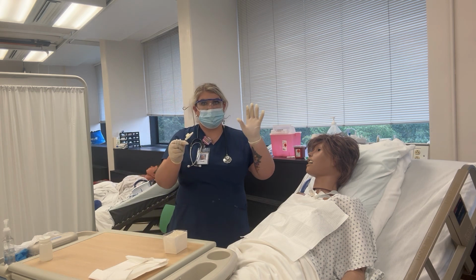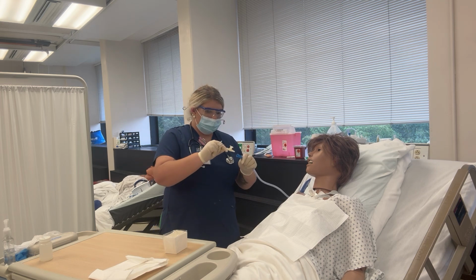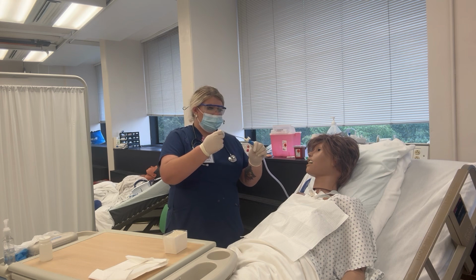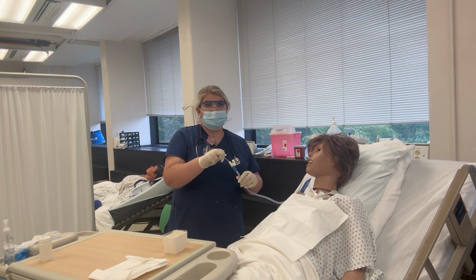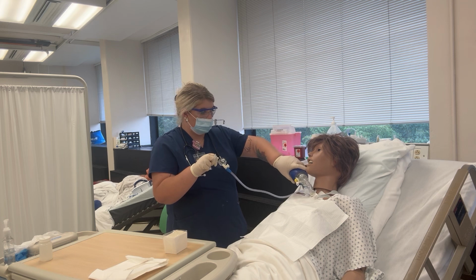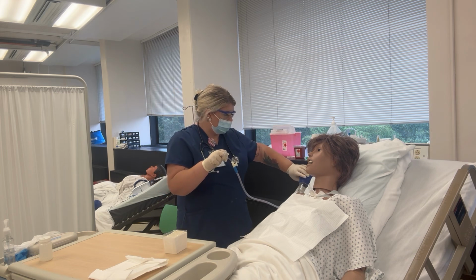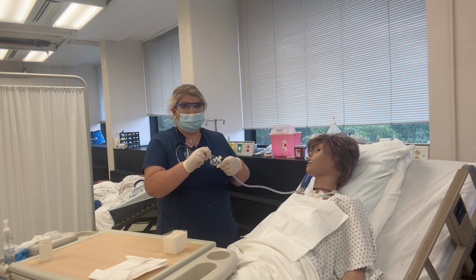This will make our non-dominant hand no longer sterile. So we're going to insert that. And then we're going to go ahead and hyperoxygenate the patient. We're going to do this 3 times. Okay. And then we're going to test the suctioning.